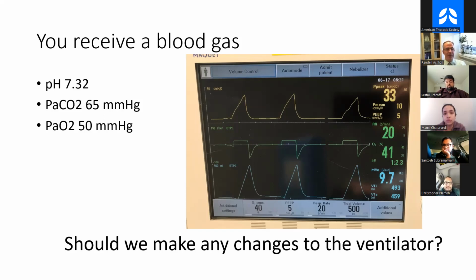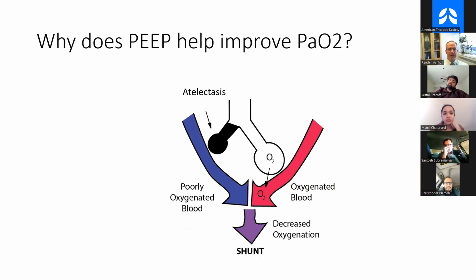A lot to unpack in there. If you didn't follow everything he said, don't worry, that's okay. But I like that. Let's talk for just a minute about PEEP. So you're saying that ideally what you'd like to do is adjust the PEEP here. Let's talk about what PEEP does, okay?